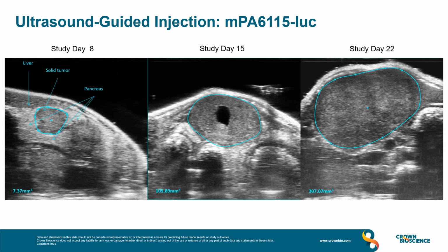And these are just some ultrasound images looking at tumour growth over time. So the images are taken on study day 8, day 15, and day 22. And you can see from the outline the way that you can monitor the growth of the tumour over this time period.